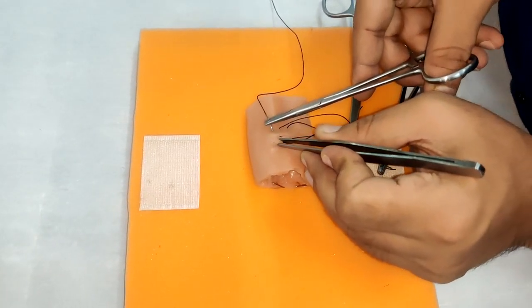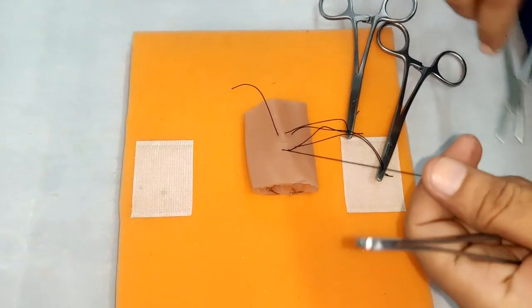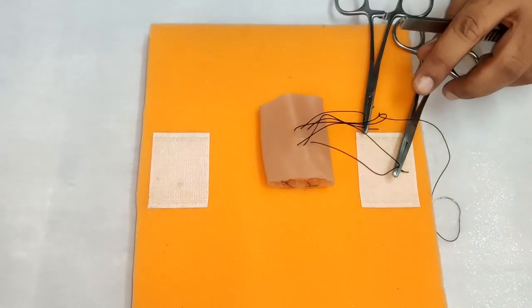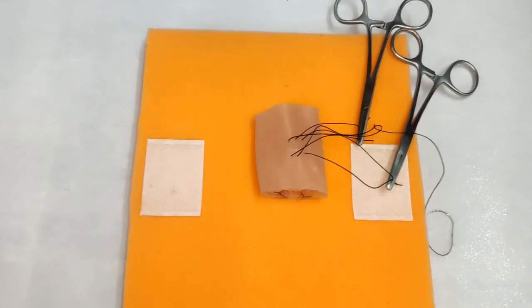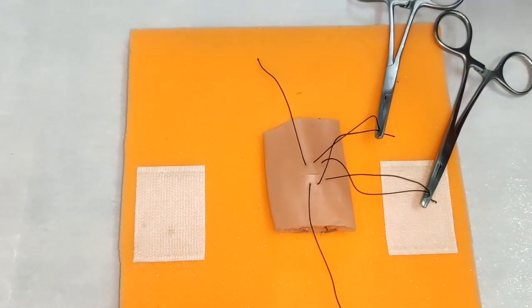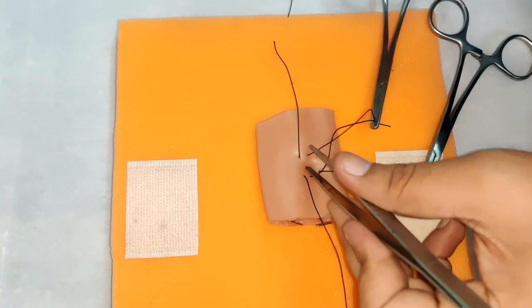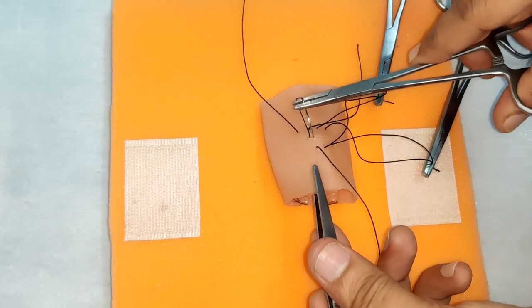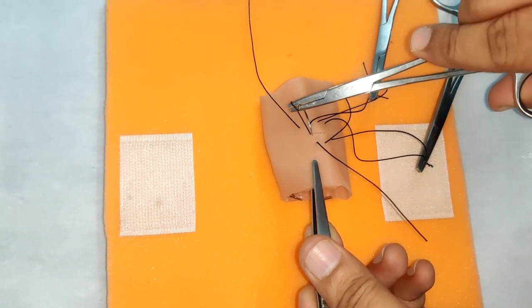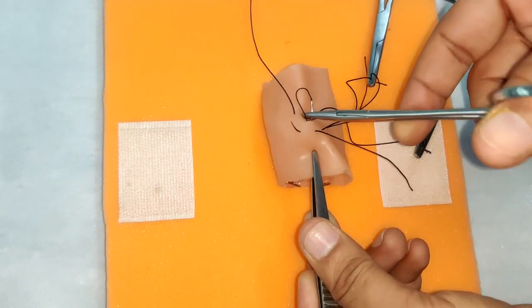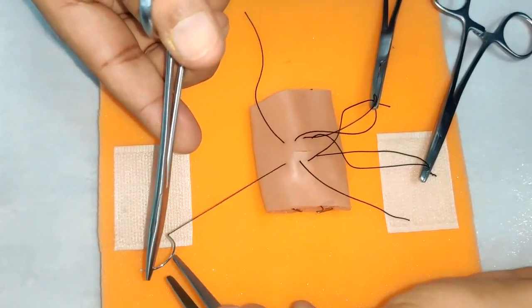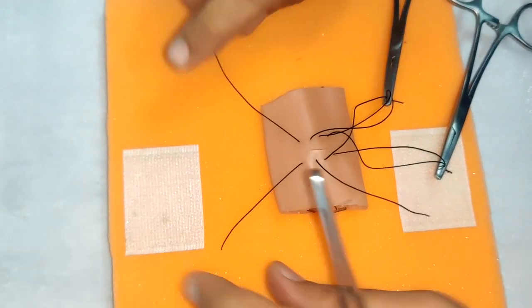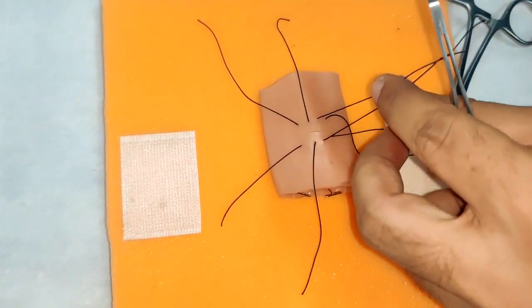And again hold it using an artery forcep and coming out from the other end. And one last suture that we will take, we will go from beyond and come out from the other end. So here we have our four layers of sutures.